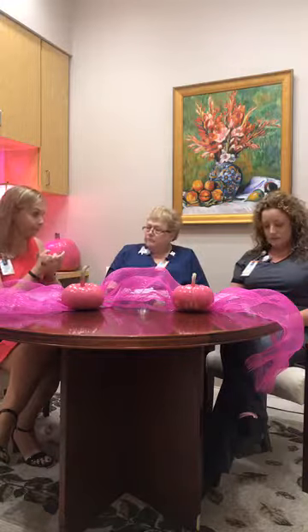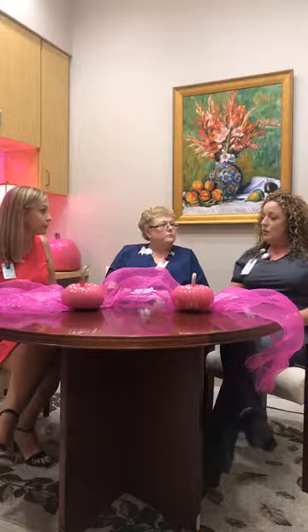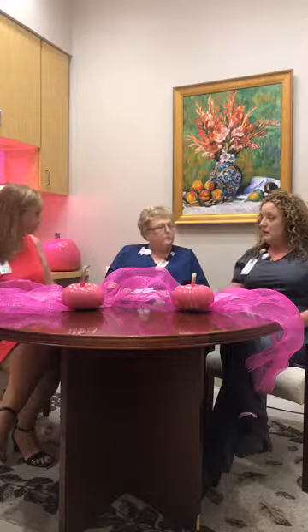Very good. Now this is something that I think is very important to make sure that we talk about. A lot of our patients have breast implants. Is there any reason why they should avoid a mammogram? No, definitely. They should come in just like any other patient. Is there any certain procedure that you do to work around that implant as you're taking your images? When someone has implants, there's going to be additional views taken. Because the implant can be in the way. It'll block some of the image.